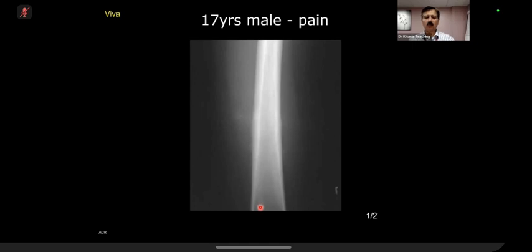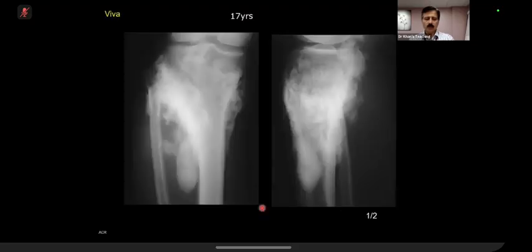Previously I have told you when we were considering infections that in the exam, always use the word initially in your description. You have to say an aggressive lesion, because differential diagnosis wise, infection might be in the differential. Don't use the words a malignant tumor in your description, and in your conclusion, of course, you can conclude it as such. Okay, over to you.